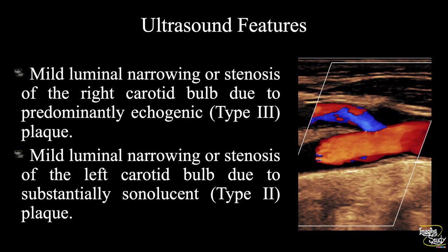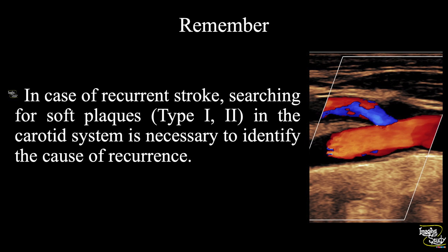In summary, mild luminal narrowing or stenosis of the right carotid bulb due to a predominantly echogenic — type 3 — plaque is noted. Also, there is mild luminal narrowing or stenosis of the left carotid bulb due to a substantially sonolucent — type 2 — plaque. Another take-home message: in case of recurrent stroke, searching for soft plaques — type 1 or type 2 — in the carotid system is necessary to identify the cause of recurrence.